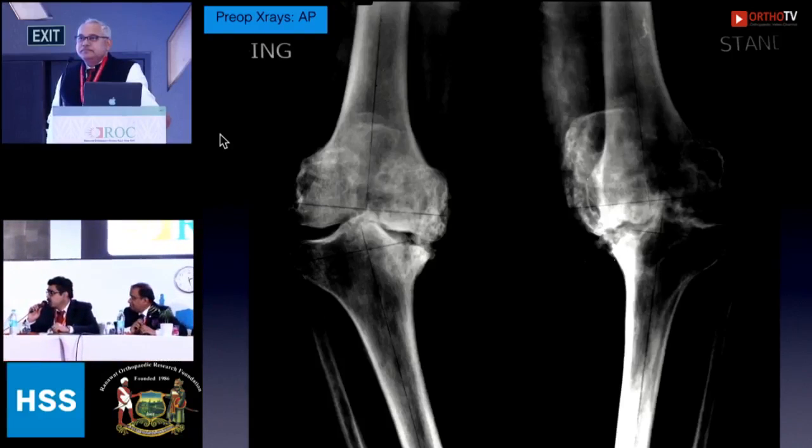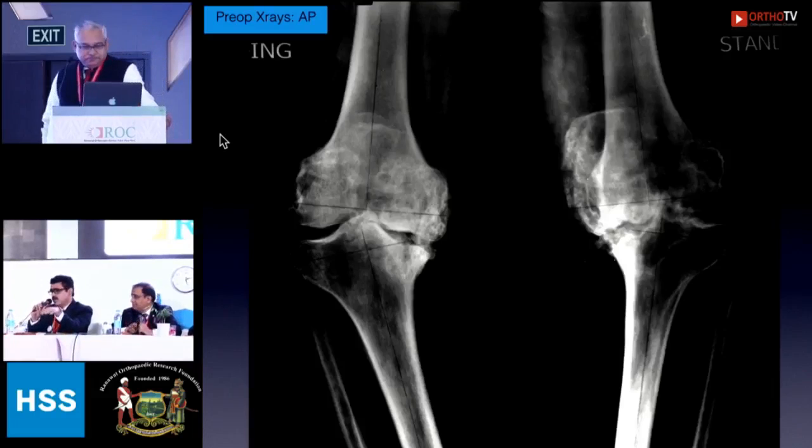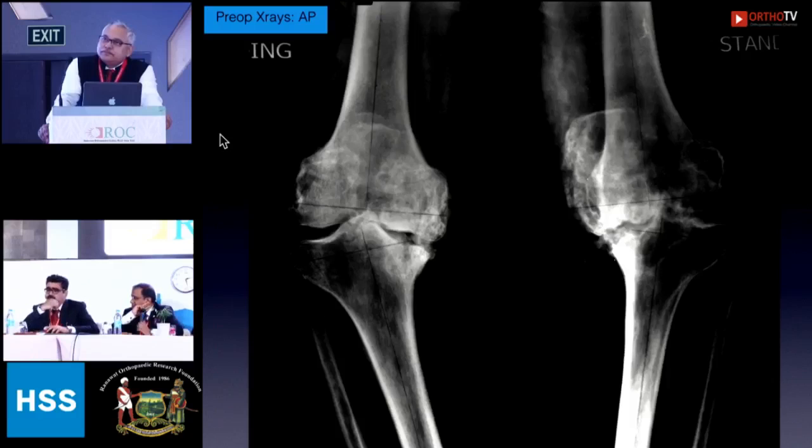So you use autograft. Use distal femur? No, the cut when we make it. I might like to build it up with the bone which I get from the femoral condyles. From the distal femur, yes. Yeah, that technique is well described. You take the distal femur, you fix it with two K-wires, and then you can screw. And most of the time, those defects can be managed with that local bone from the distal femur.